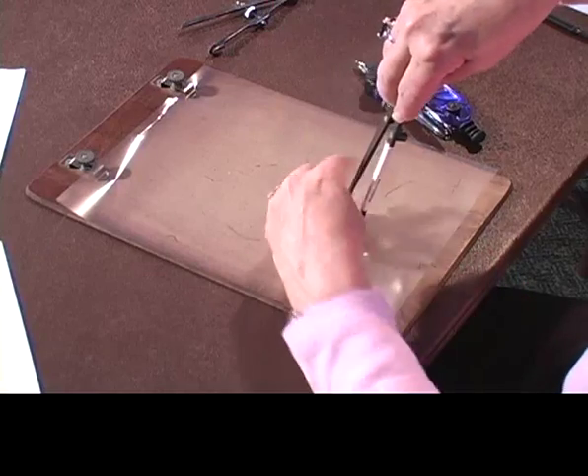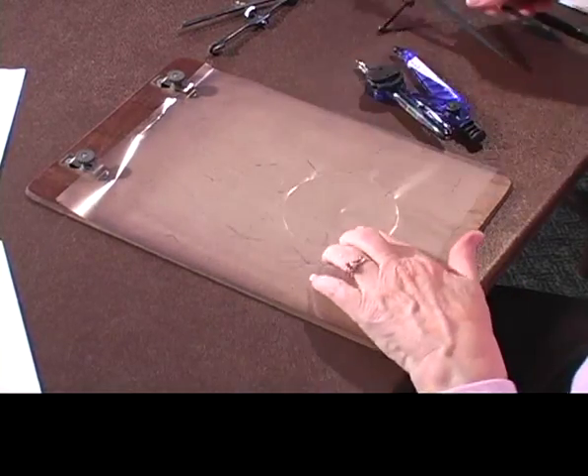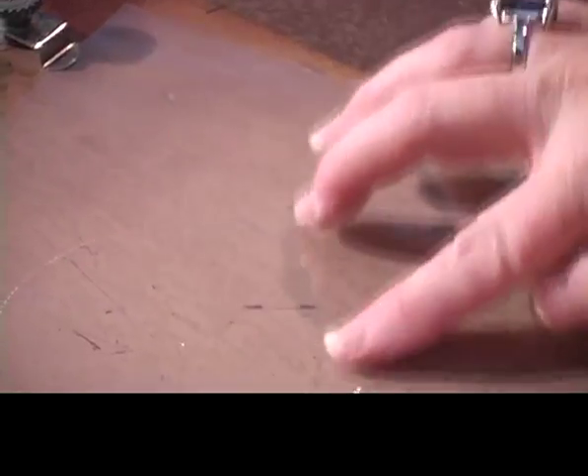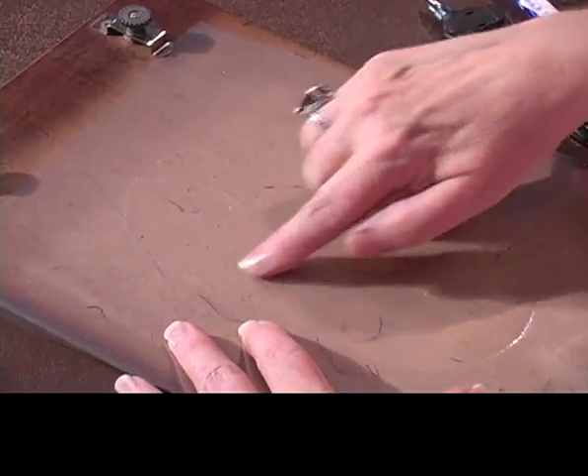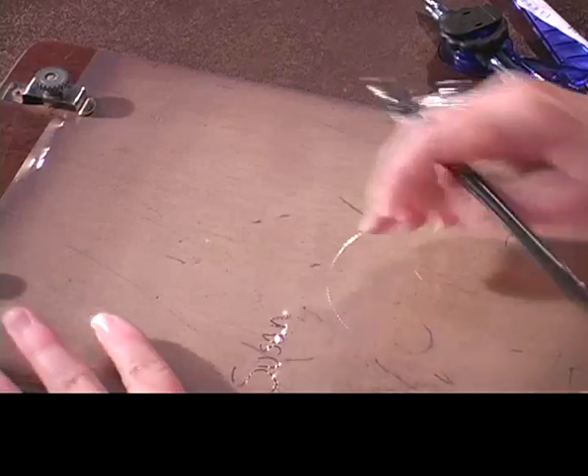That's why I went to the Braille paper — because I did not like this flimsier plastic paper, so I will just warn you about that. Now I can kind of feel that. I think I can feel it better on the other side. If I turn it over, I think I can feel that a little better on this side, but I had to turn it over. The point is supposed to be that you're supposed to be able to write on this side and be able to feel it.